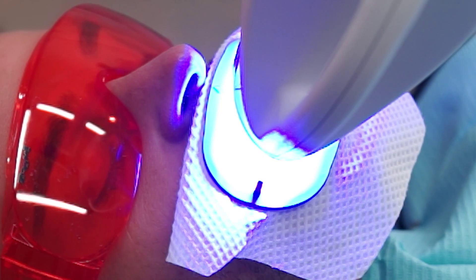Most patients prefer during their whitening sessions to listen to their own favorite music with an iPod. This makes them relax and think about something else while having their teeth whitened.